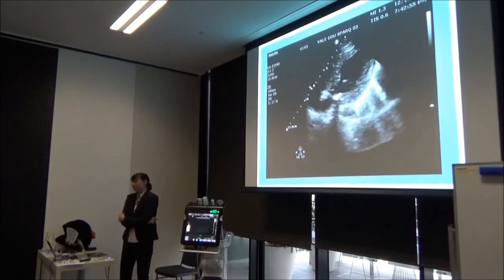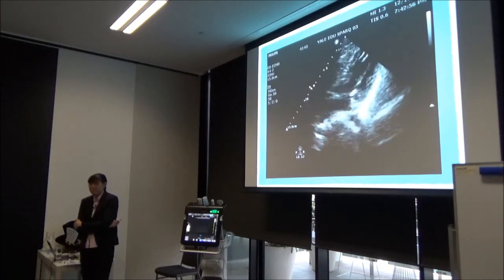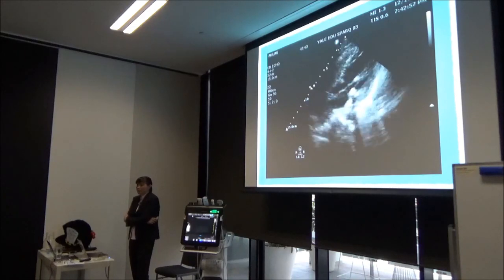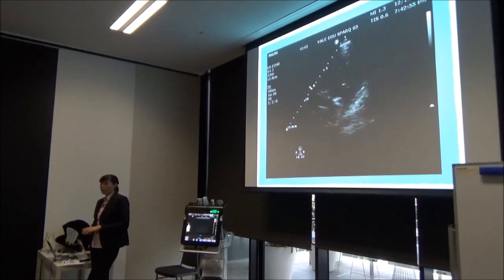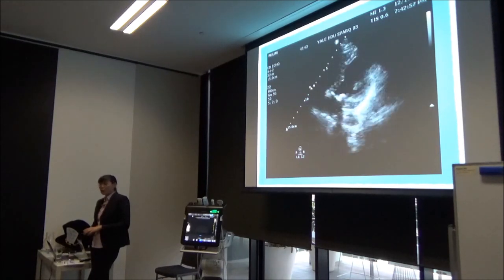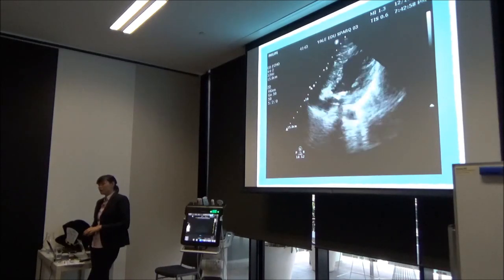This is with the Lucas. What do you think? This is very interesting in the pre-hospital world because the Lucas was supposed to give us a lot better outcomes, which hasn't borne out. Do you think that the Lucas is delivering effective compressions?